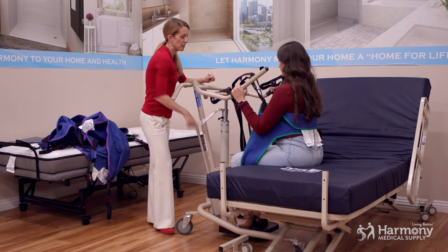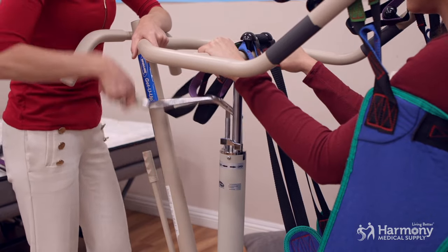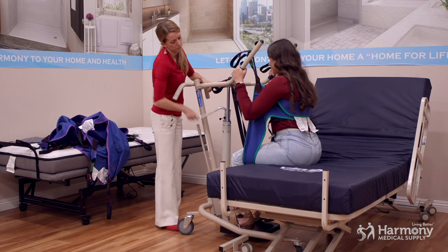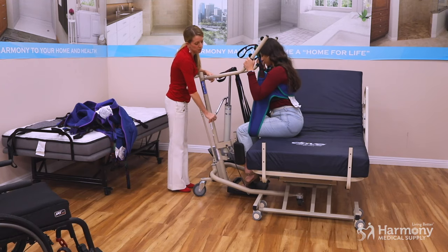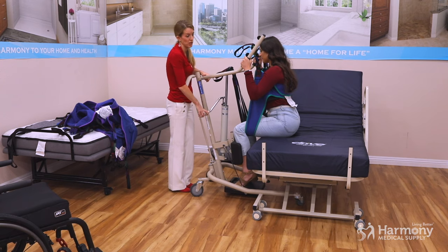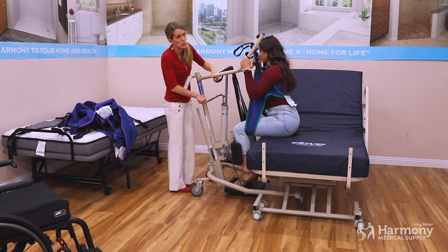Start to do the lever — it takes a few pumps but it's not heavy. It takes a minute for the sling to start to lift them up. Because this one has the leg piece, it's going to pull her legs up more, similar to a patient lift. On the ones without the leg piece, it's pulling them up around the waist and not putting that pressure behind the leg.